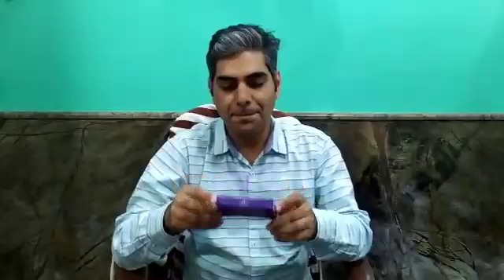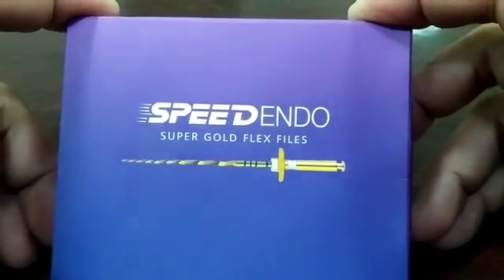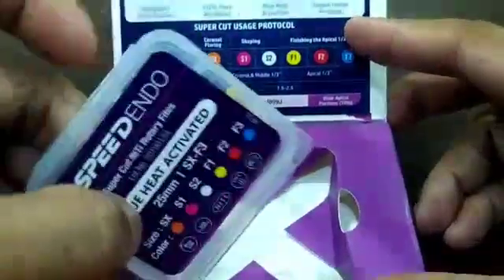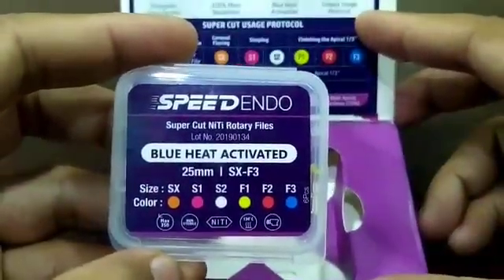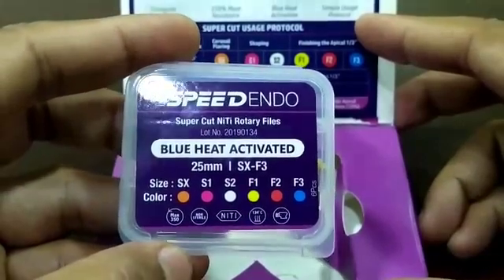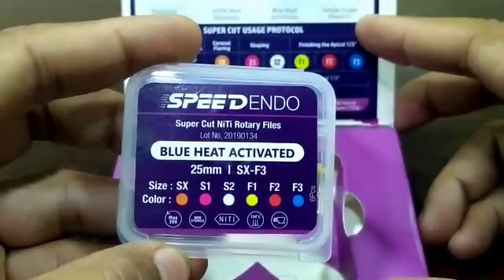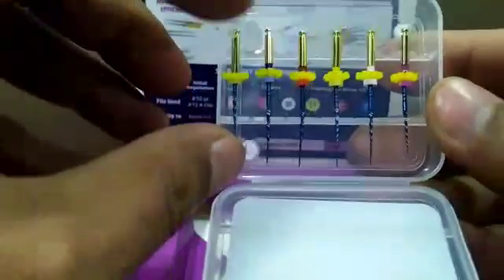Hello friends, I am Dr. Sukhwan Diyadav and I got this file system from Pink Blue — that is Speed Endo Files. These are blue heat-activated files. Let's open the Speed Endo Files. These are files with an autoclavable pack, and there are six files inside: SX, S1, S2, F1, F2, and F3. This is an assorted pack.